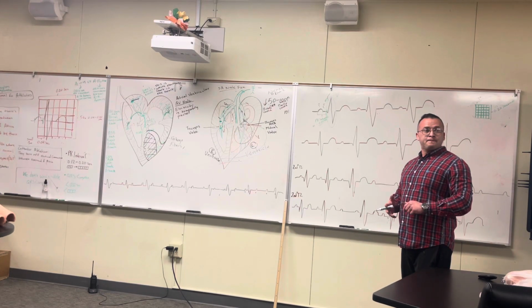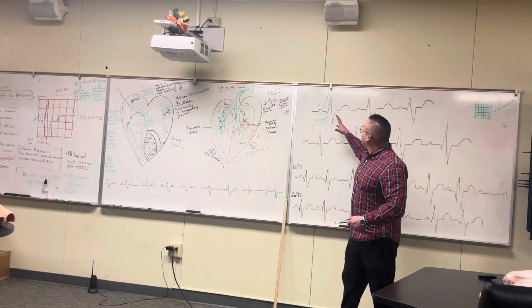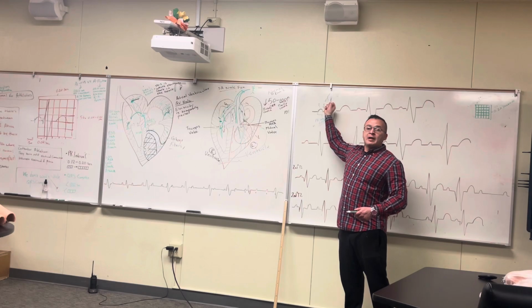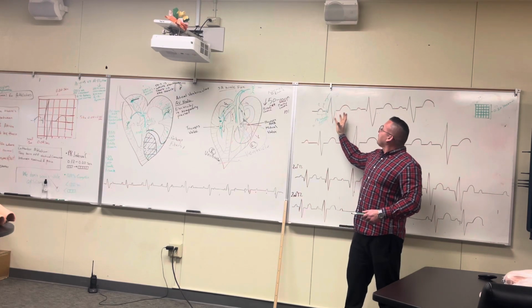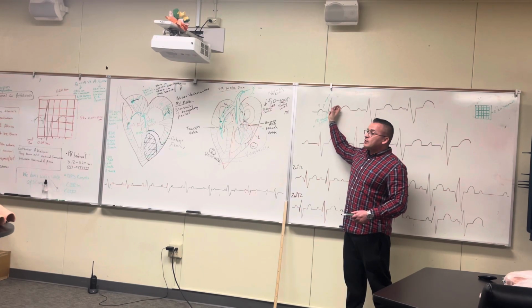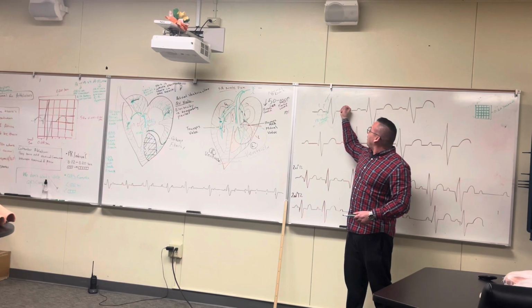It's called the ST segment, but what does it mean though? Like what's going on in the heart? So we know that the QRS is the physical squeezing of the ventricles because electricity is currently going through there. So here is the electricity traveling through the ventricles, and this line represents that squeeze, it's holding, getting every last little drop.